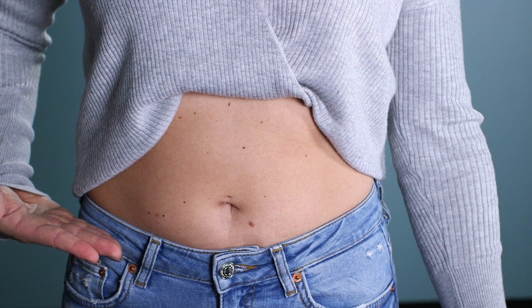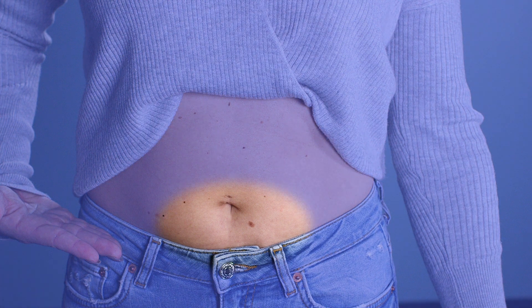For subcutaneous injections, make sure you wash your hands with soap and water. The most common site is the abdomen, using the left, right, or below the belly button, and staying approximately one to two inches away from the belly button. You can also use the back part of the upper arm or the outer aspect of the upper thigh.